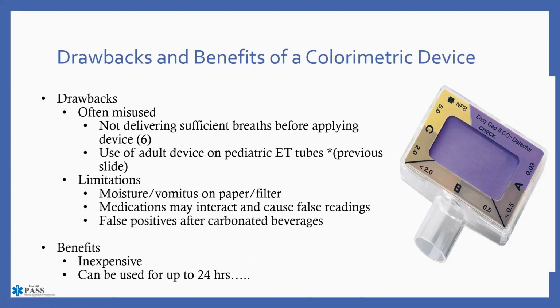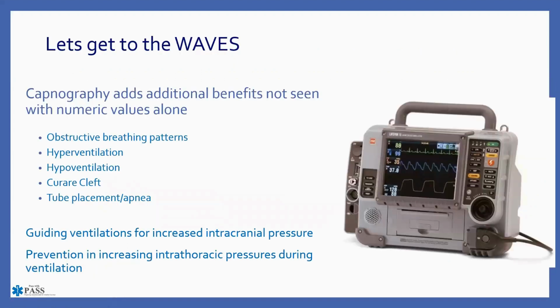There are other situations where that is a possibility, but if you just simply go back according to the manufacturer, deliver those tidal volume breaths, hopefully that won't be an issue for you. The benefits: it is inexpensive. I'll give them credit where credit is due. And then again, according to the manufacturer, this can be used for up to 24 hours. I put some ellipses here because we all know if you've ever used this, that's truly not going to be the case.